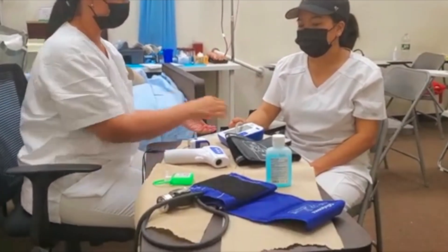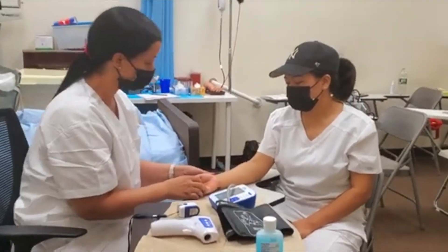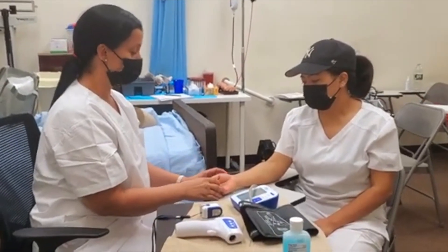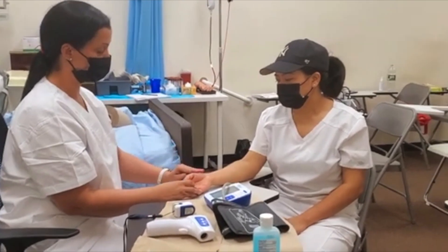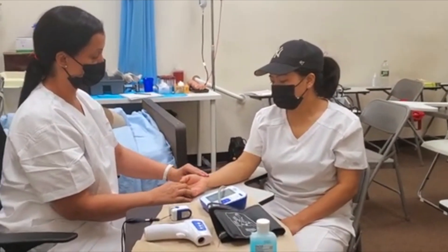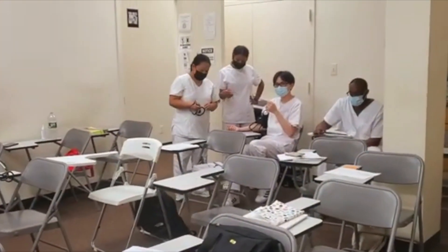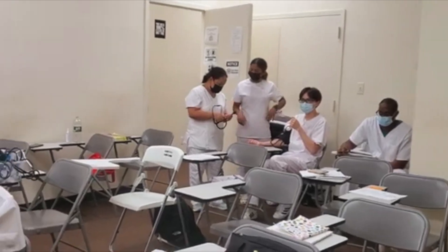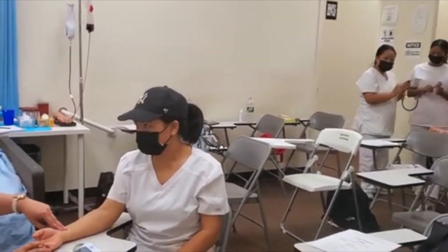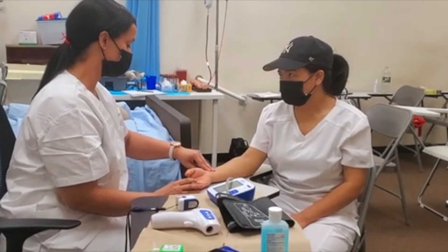We're also going to check the radial pulse. We're going to press two fingers on the radial pulse, and we're going to count the pulse. As we're doing this, we're also going to check for respiration, but we are not going to announce it. We're going to count the pulse for a full 60 seconds.